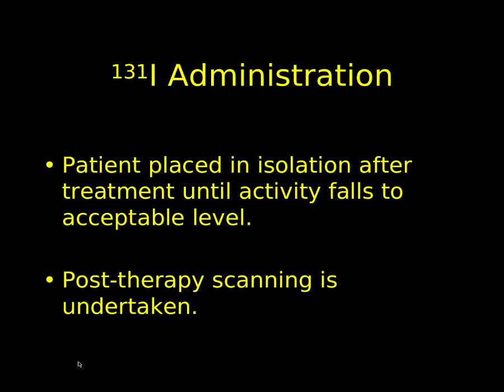So usually the patient will be brought to a special room on the ward where these sort of treatments are administered, and they'll be given a pill containing the radioactive iodine. The patient stays in the isolation room until the activity in their body falls to an acceptable level. The vast majority of the tracer will be rapidly excreted through the urine.